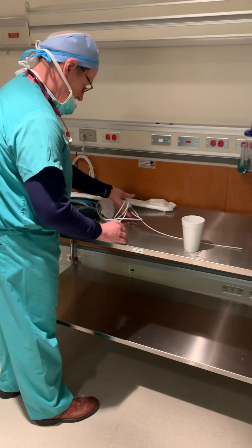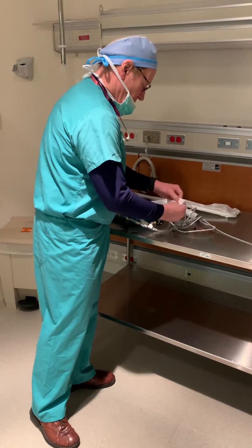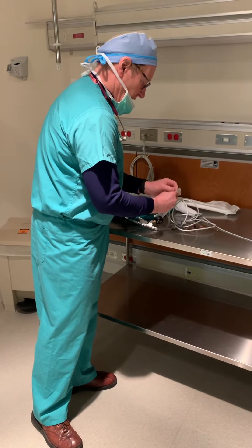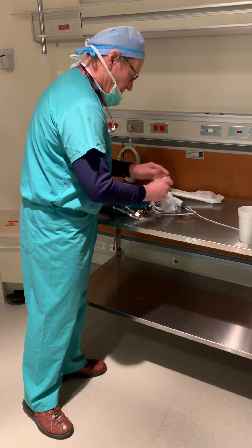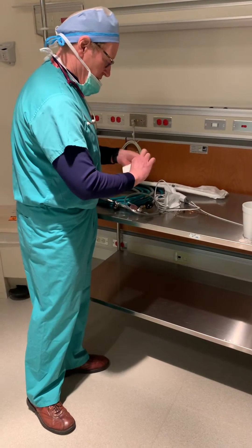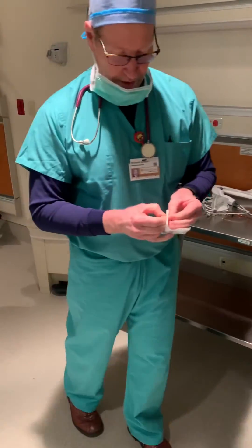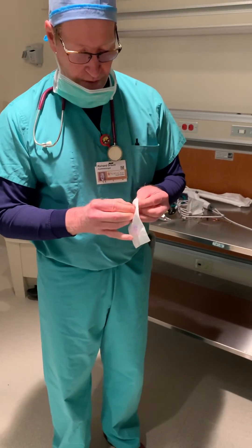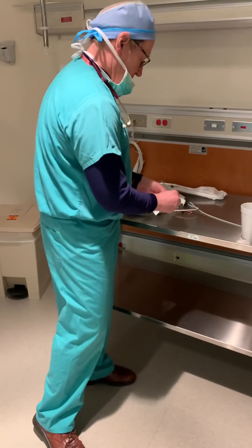There's a little attachment right here that allows you to put this onto the end of the bronchoscope, and then you can hook up your jet ventilator to it. It's real simple, but it's a very nice play to have in your playbook, because this is not something you can do very easily with a regular bronchoscope.